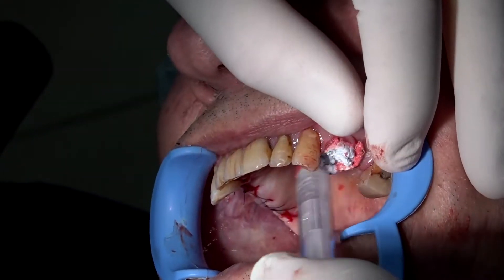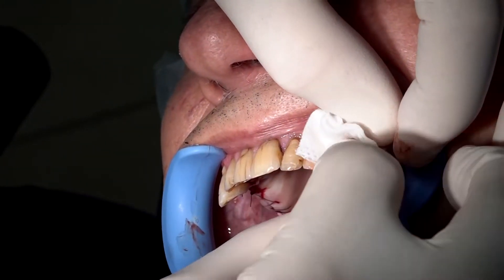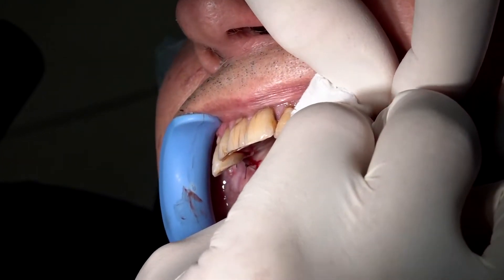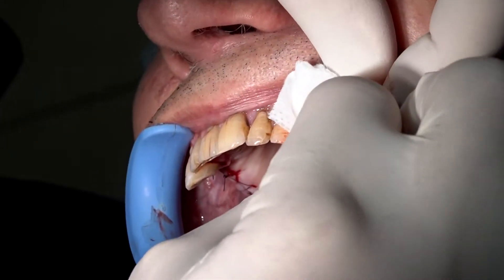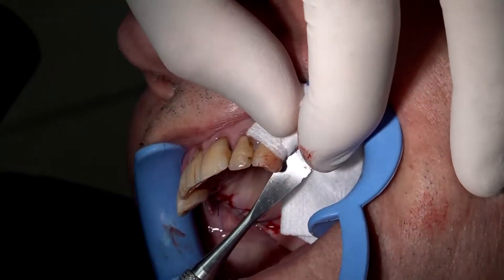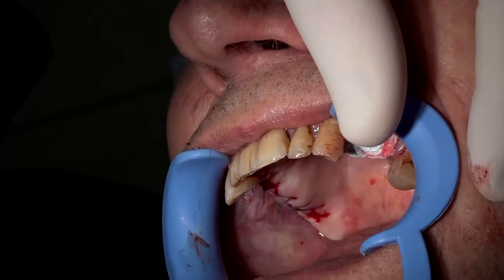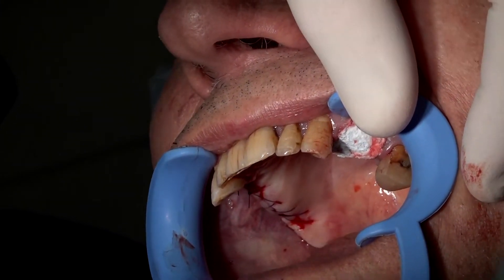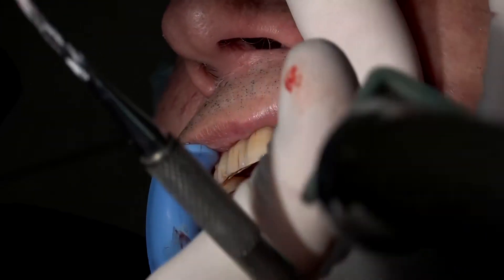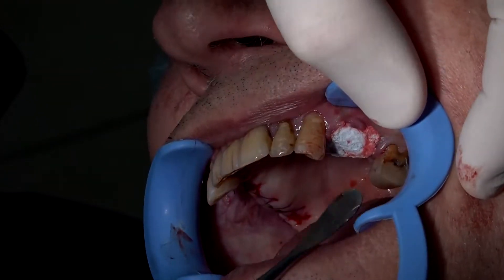We slightly overfilled. We press again, first with the finger for 3 seconds, and then adding compaction with a periostal elevator on the gauze. Now the material is already set. We can remove excess gently.